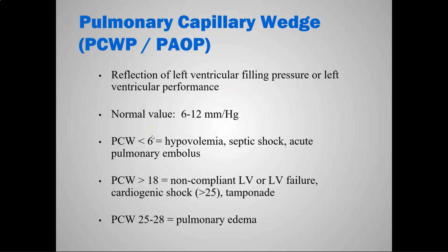We're going to move past that. This, I do need you to understand the concept, or conceptually, I need you to grasp this. So our pulmonary wedge pressure, okay, pulmonary capillary wedge pressure, pulmonary artery occlusion pressure, same thing, is a direct reflection of the left ventricular filling pressure. So in other words, how much pressure is in the left atria currently filling the left ventricle, okay? Or the ability of, not the actual left atrial pressure, I apologize, that sounds like a misrepresentation, but the ability to actually fill that left atria full, and for that atria to then subsequently fill the ventricle, okay?